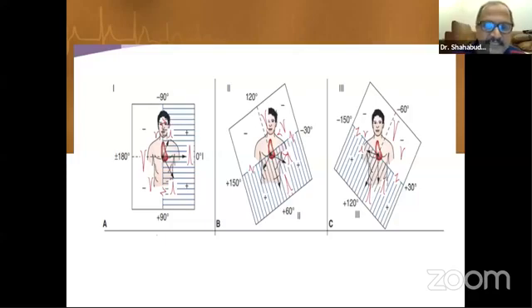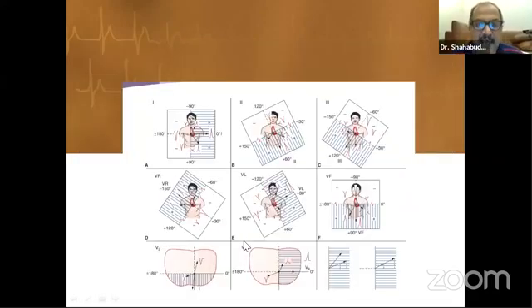We have to consider these things that we already know about. And this is another for aVR, aVL, and aVF. This aVF is directly at a right angle to lead 1, and we will discuss this relationship in the discussion of the electrical axis of the heart.